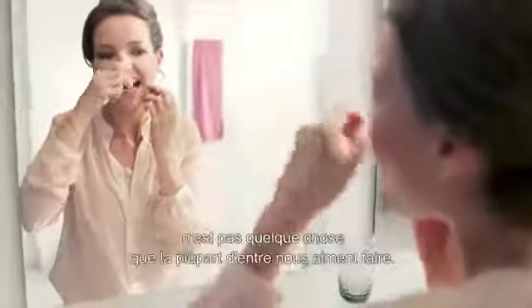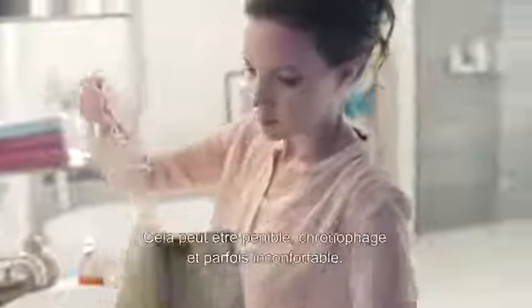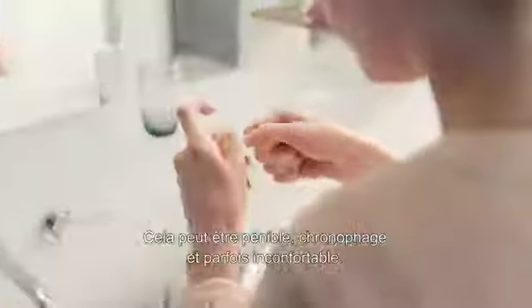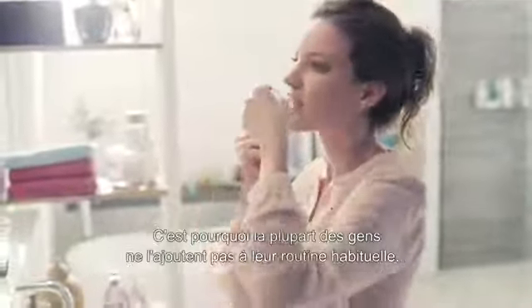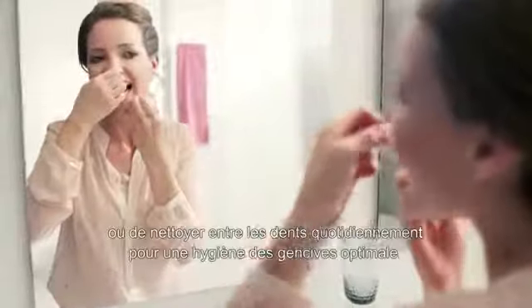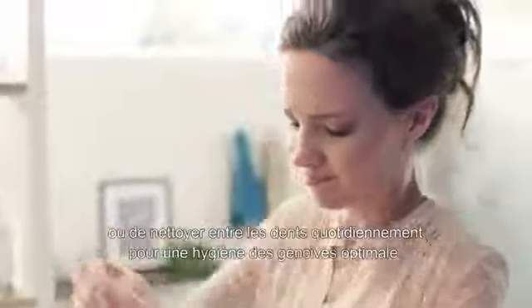We know flossing isn't something most people like to do. It can be annoying, time-consuming, and sometimes uncomfortable. That's why most people don't add it to their daily routine, even though their dental professional has told them to floss or clean in-between teeth daily for optimal gum health.